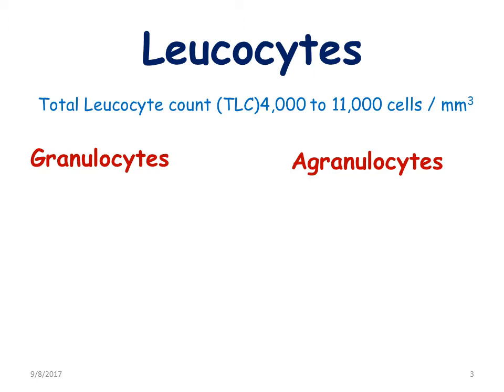So, in other words, when you are looking at these cells, the red cells will appear red to yellowish red, whereas the neutrophils will appear with dark purple nuclei, a pale pink cytoplasm, and neutral-colored granules. Eosinophils will have blue nuclei, pale pink cytoplasm, and red or orange-red large granules.